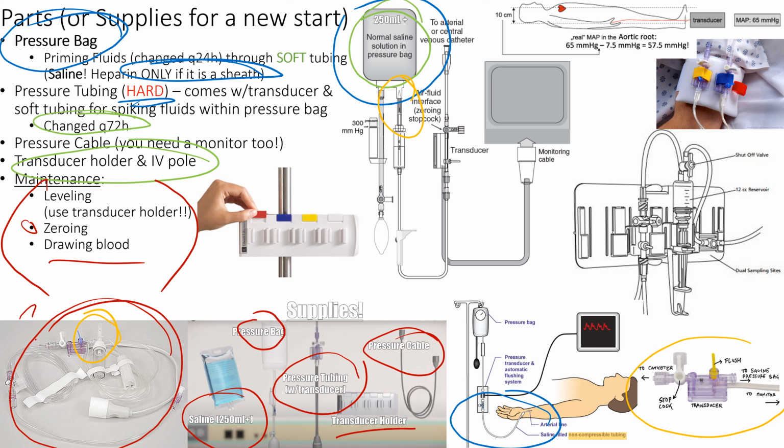All right, what else? So we remember our transducer. This, again, remember, is called our vamp. That's just a way to avoid infection, because with the OR style, it doesn't have this syringe in a closed system. So you have to attach another syringe every single time, which can introduce infection into the line. So we have these vamp systems that maintain sterility. So you only have to pull all the fluid back, right?